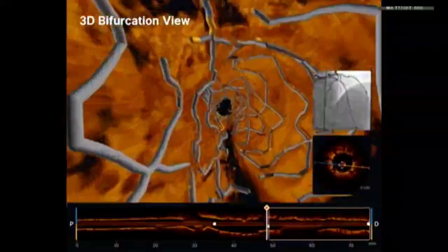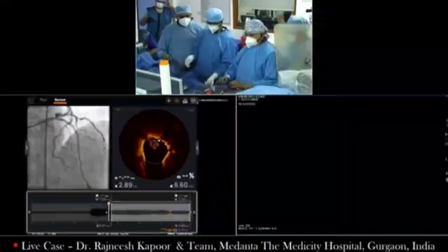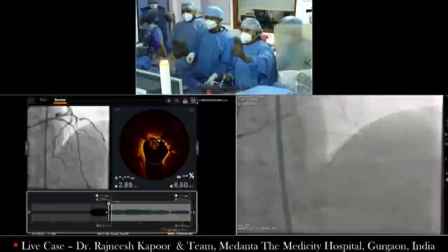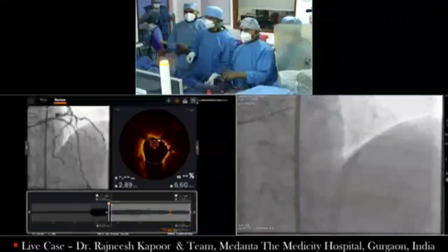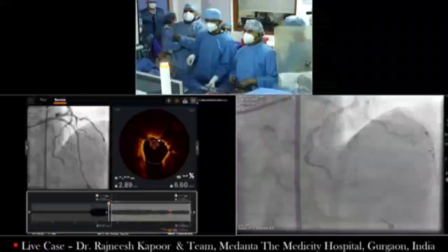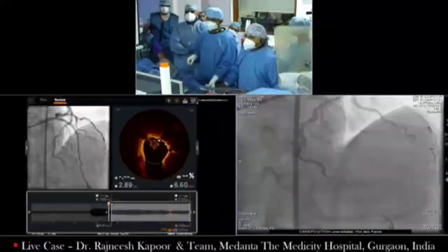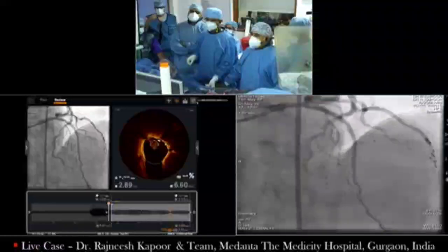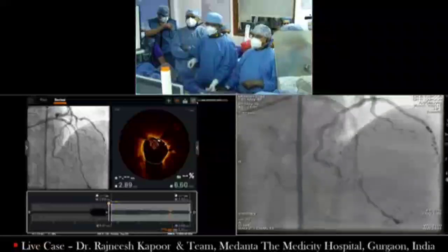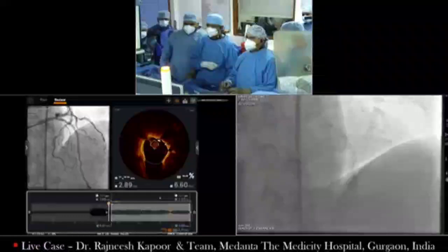Thank you. Give me a post-dilating balloon, NC, first 3 and then 3.25. So I can just congratulate both Dr. Chandra and Kapoor. Excellent demonstration of how to apply modern technologies to prepare calcified lesions and perform stenting. So congratulations to both. This is the last shot. Look at this. So where we started and how the vessel looks like. And although I think we are not having enough time, so this is the last angiographic shot. Still some post-dilatation required at the tightest point around diagonal.